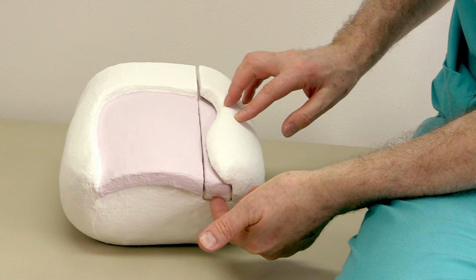The toe is cleaned and numbed. A couple of scratches, that's all. The anaesthetic will last well after the procedure is complete. A tourniquet is applied. The nail plate is loosened from the nail bed just in the area to be removed.